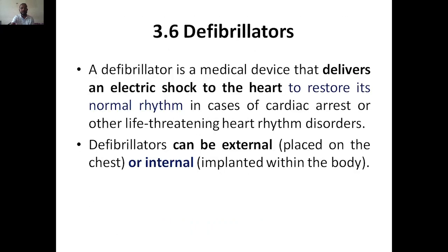In this topic we are going to study in detail what exactly defibrillators are, what materials are used, and what the purpose is. All those things we are going to study. So far we discussed almost all topics under the heart. This is the last topic of this module.